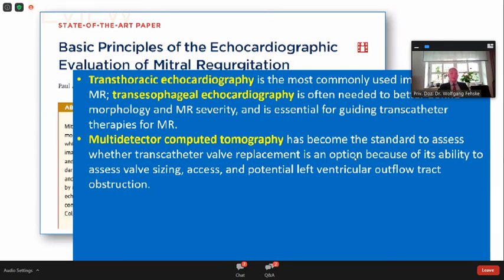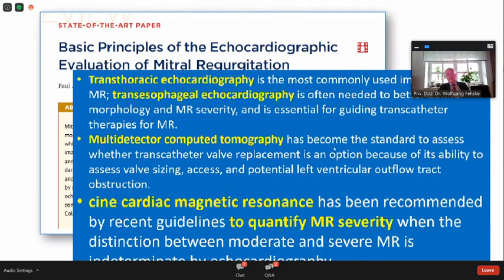But what he says is that cardiac magnetic resonance should be the reference method. I do not believe this because we have too bad experience and too little experience in our daily work with magnetic resonance imaging for measuring the stroke volume. This might be possible for aortic regurgitation, but it depends on flow measurements and not on volume measurements, just by planimetry of the images we see.